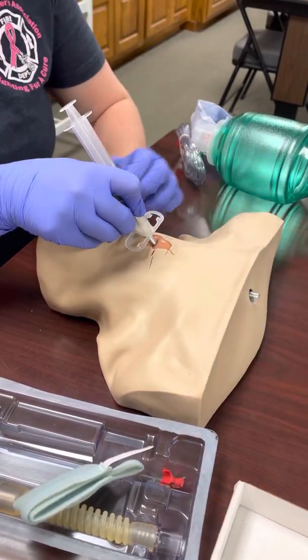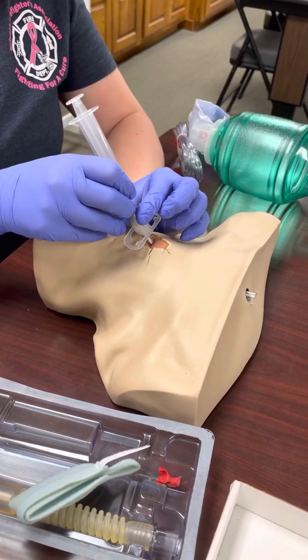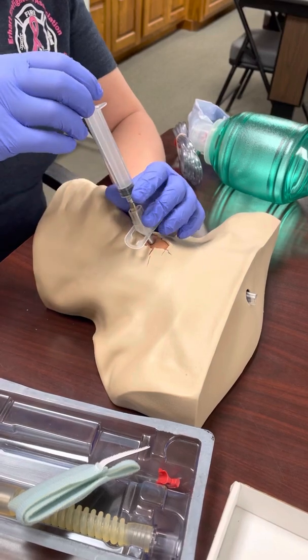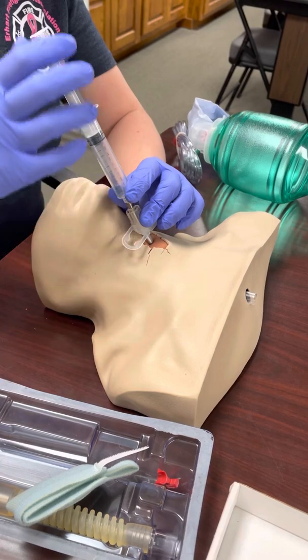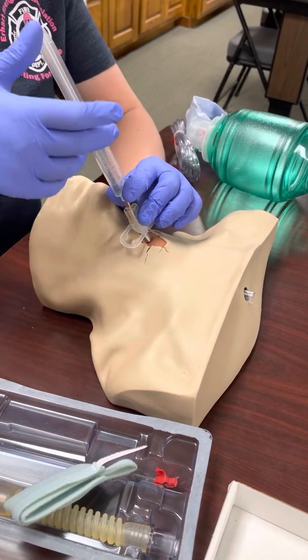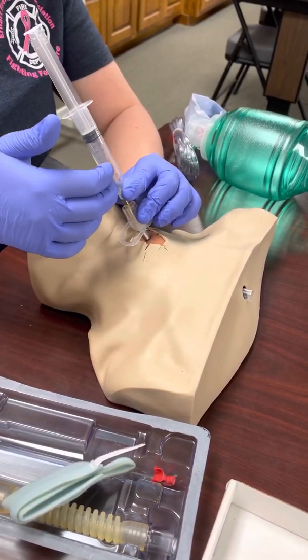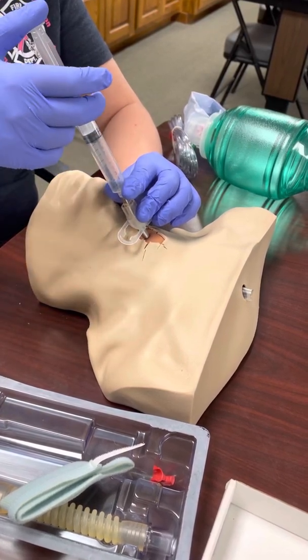Sometimes the red stopper comes off on its own once you hit it, or just remove it — you don't want to advance the needle any further. Before sliding it in place, we need to aspirate. Pull back on the syringe to confirm placement. If you get a lot of resistance, you could be in the esophagus. You should get a mixture of air bubbles with some blood, because it is a messy procedure — a little blood is normal, but you should also see a lot of air bubbles.